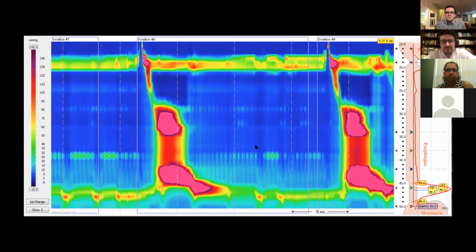You might see some peristalsis mixed in there, some contractility. If you just have aperistalsis, but you find a single panesophageal contraction in the whole study, just one single panesophageal contraction, then that would prompt me to call the whole study achalasia type 2, even though most of it looked like type 1.